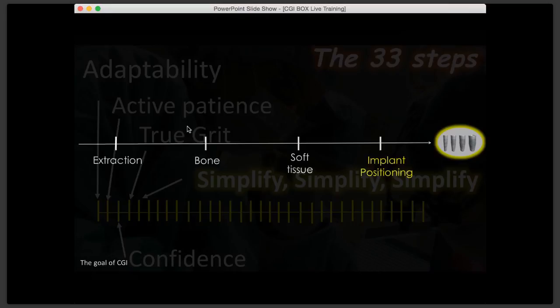You submit basically to the guided company, and they will scan it for you. You source it out. Now, if you have an optical scanner, you don't need the impression. Okay, and I'll talk about the question whether you need an impression, an optical scanner or not. That's very important.